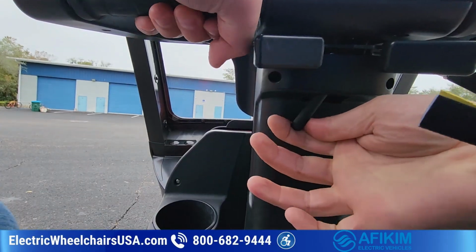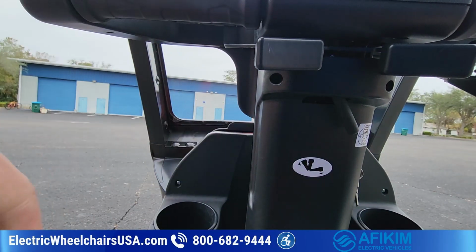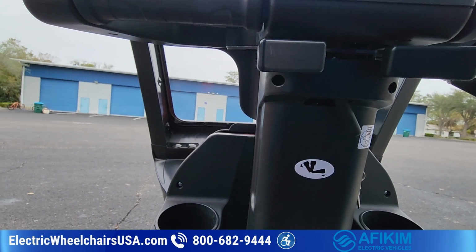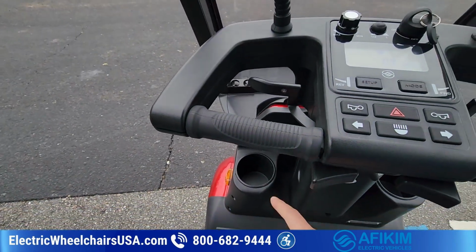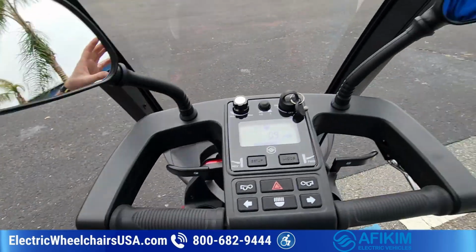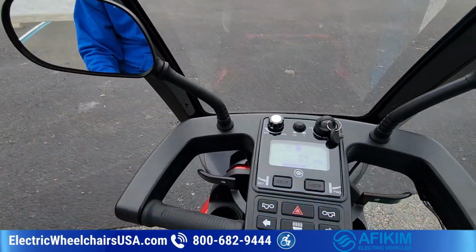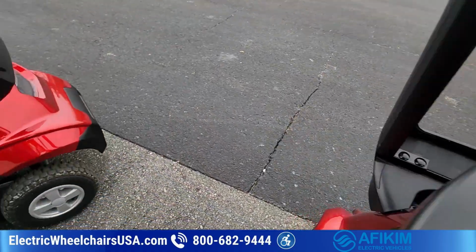This is how you would adjust the tiller towards you or away from you. So it's like a hydraulic mechanism where you can just pull it towards you or away from you. And that's in addition to the seat sliding forward and backwards. You've got 2 cup holders. And the mirrors are also adjustable. So that's the controls on the C model.